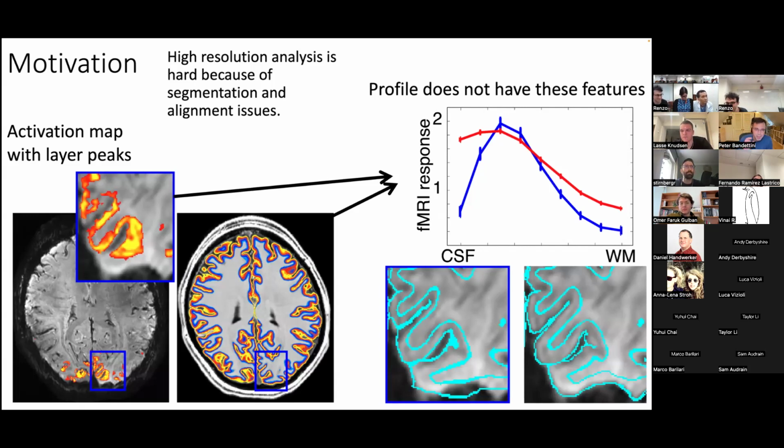But in this context, one thing that wasn't clear is that you can reverse the polarity of the gradients. But if you wanted to use this as a separate scan and then collect your EPI and then register the two, it wasn't clear what you would do. Would you just use half the data? You said you had adjustable distortion, and that wasn't clear to me.